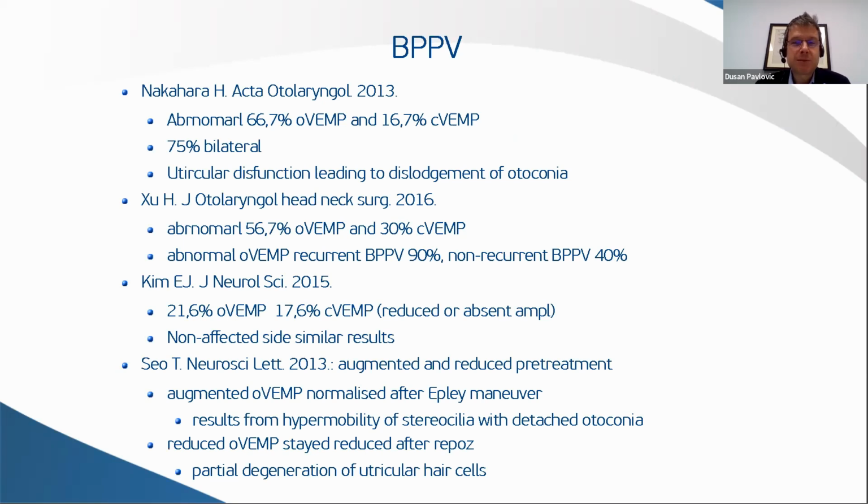I must admit that personally, I usually don't perform VEMPs in BPPV patients, but as you can see from these studies, pathological values are present, not so rarely, and especially in ears with recurrent episodes of BPPV. Yes, I consider it useful in patients with recurrent BPPV to check VEMPs, especially OVEMPs.